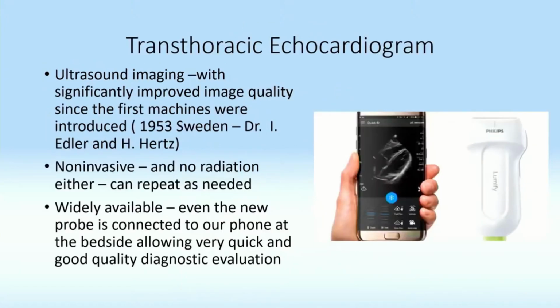Then there is the transthoracic echocardiogram. You can see the size of that machine back there. That's the ultrasound imaging, with significantly improved image quality since the first machines were available.